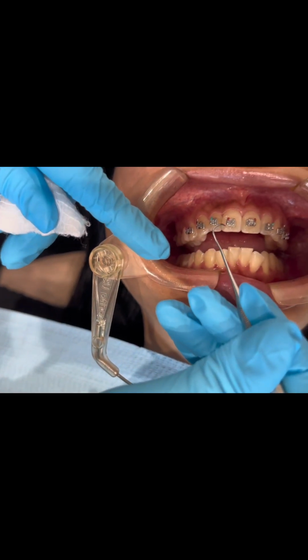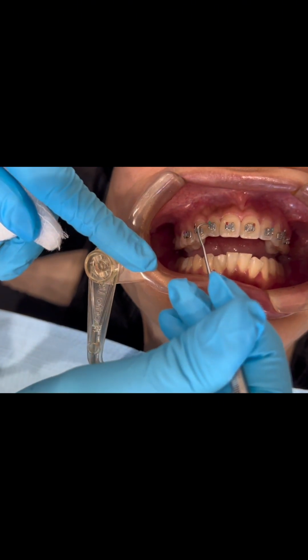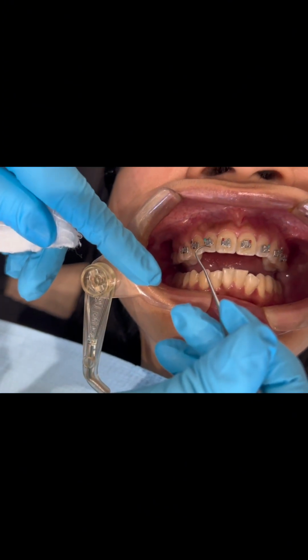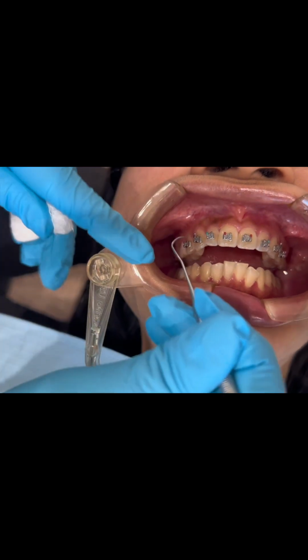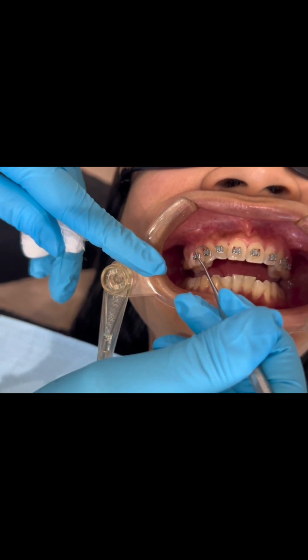But if you're just a beginner, just go ahead and put it on the center of the tooth just like this, and he'll get it, okay? He or she. We work with 2 of them. They're both wonderful. We're gonna call them Dr. Blue and Dr. Red.